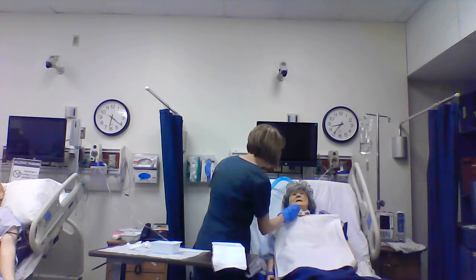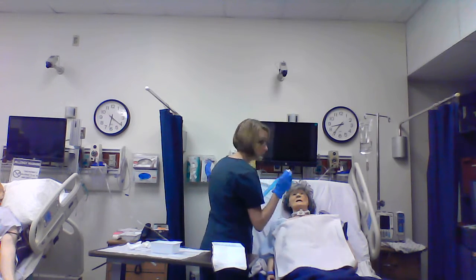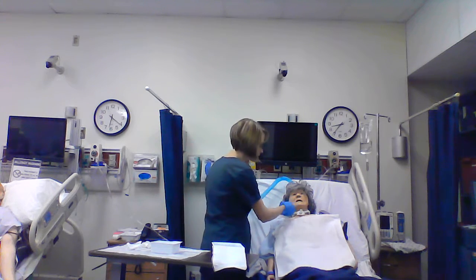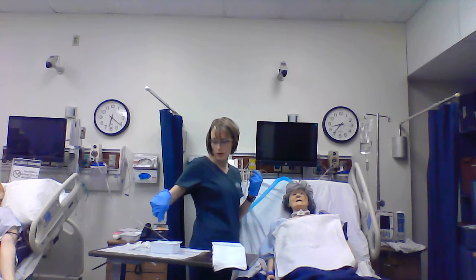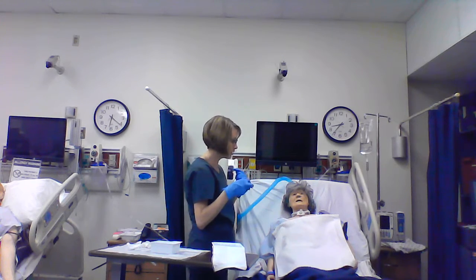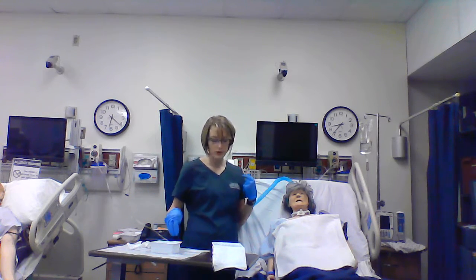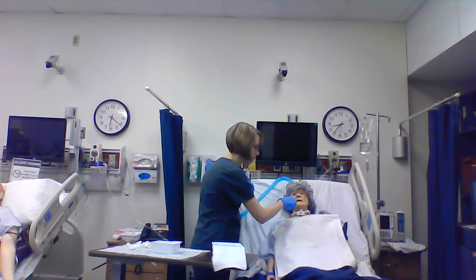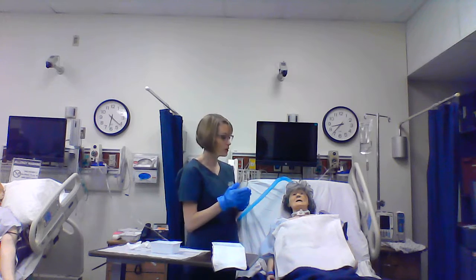So I would go ahead and clean. You want to clean off her flange. You can use the Q-tips then to clean around the incision site underneath the flange as well. So I would throw that away, get a new clean one, throw that away, probably get a Q-tip to clean very thoroughly around the incision site, make sure that it's clean, and throw that away. And then you would want to take some more sterile gauze and make sure that she's completely dry. Flange, incision, all the skin around the tracheostomy is extremely dry before you put a V-sponge back in.